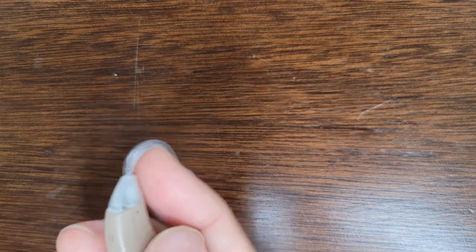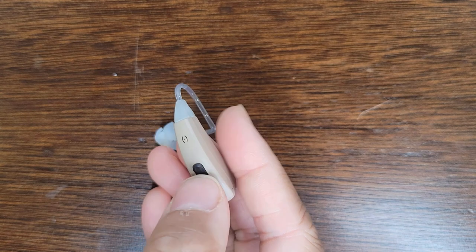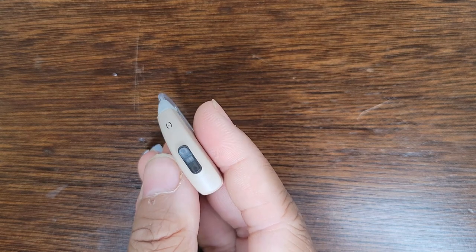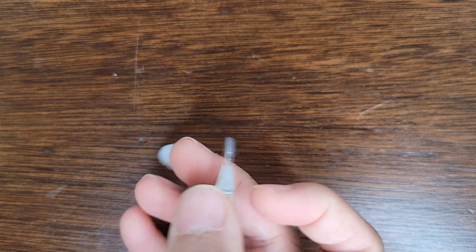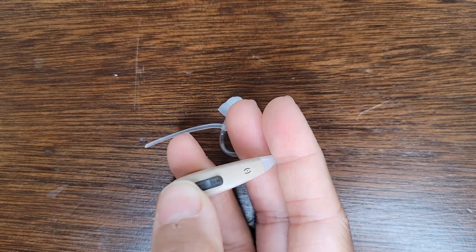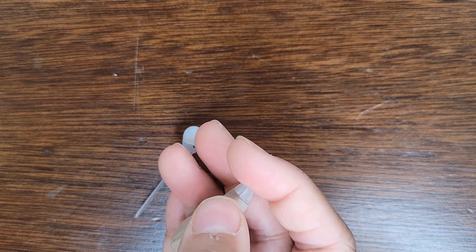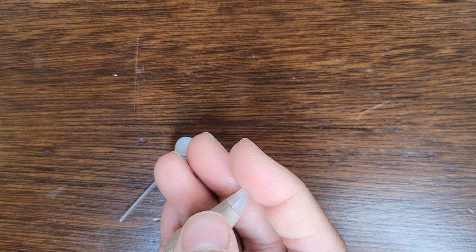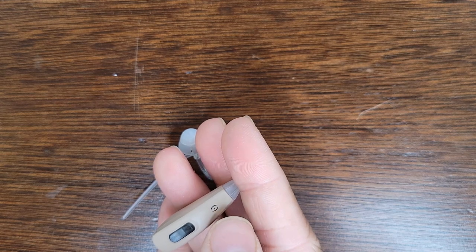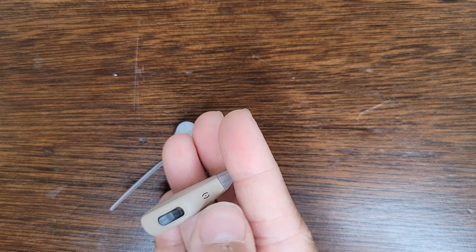And then we have our microphone right here. This is our rocker switch, the black one right here. It controls your volume, so you can go up to increase like that, or go down to decrease. You're also able to use this rocker switch to turn on and off the hearing aid. So to turn it on, you would just press and hold the upper portion for 3 seconds.